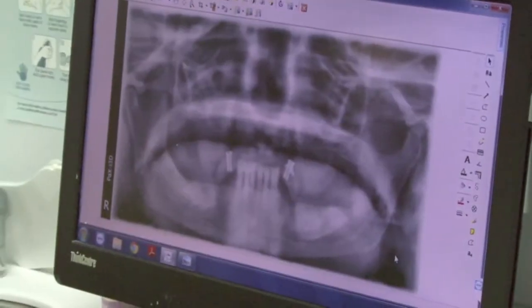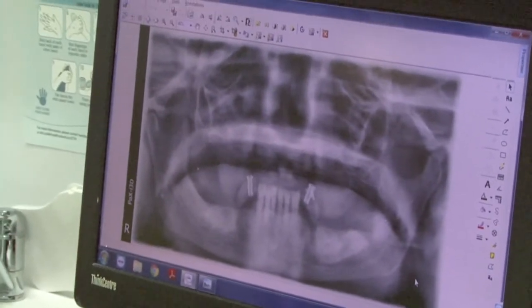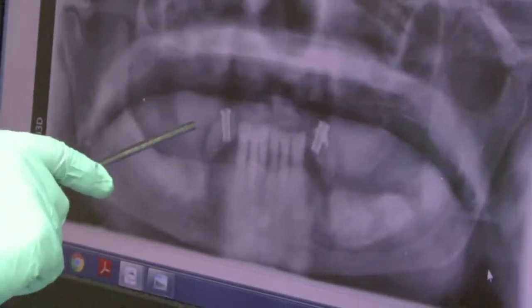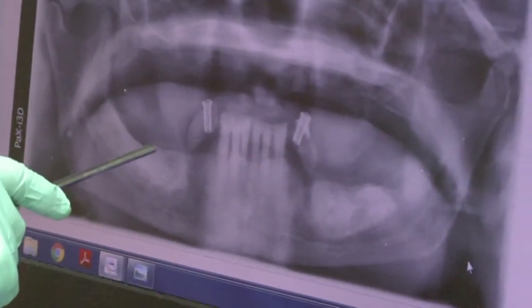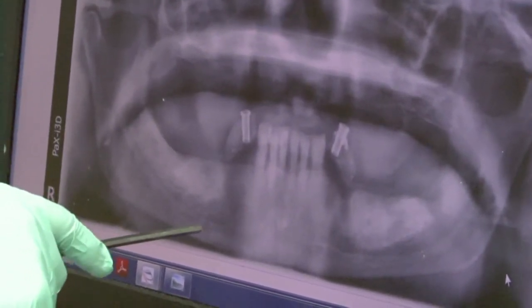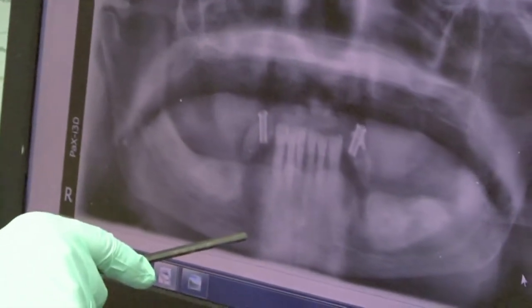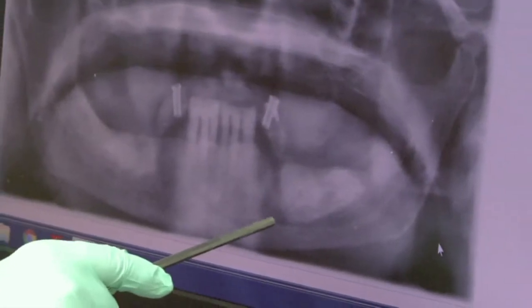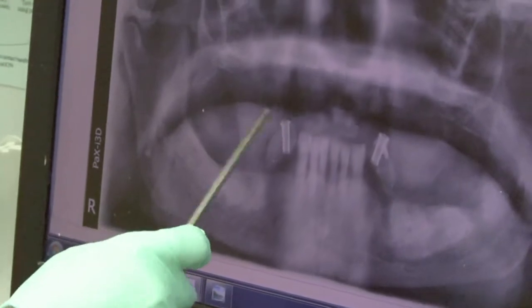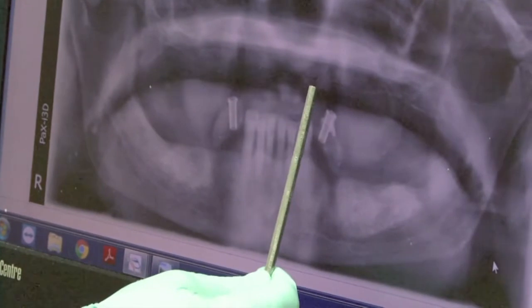This is a panoramic radiograph that was taken just a half hour ago, and you can see that we have some metal here and here. We're interested in seeing where the mental foramen is. The metal tends to intensify on the radiograph where the mandibular canal is and where the mental foramen is. So you can see the mental foramen on both sides. We're not too much concerned about the angulation that we see in this metal. We're going to correct that when we get into the mouth.